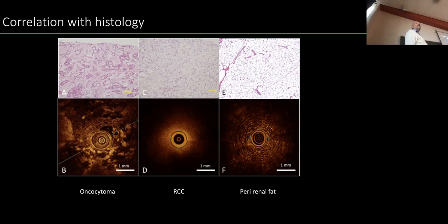Well, in the study, we did that because we want to compare it. We hope to prove, we did it now in 160, 170 patients, that it already showed us quite good results, but we have to extend that study. And we hope that a technology like OCT will one day replace the invasive biopsy procedure.